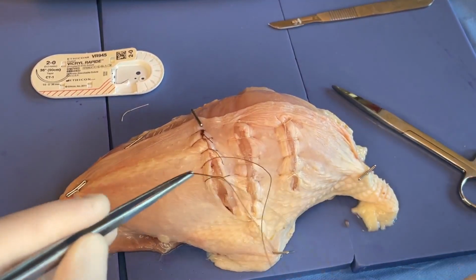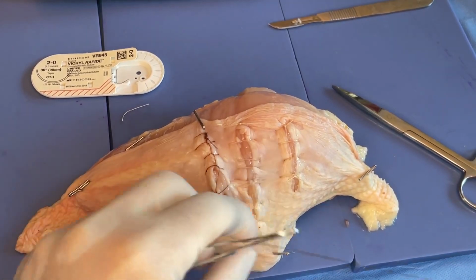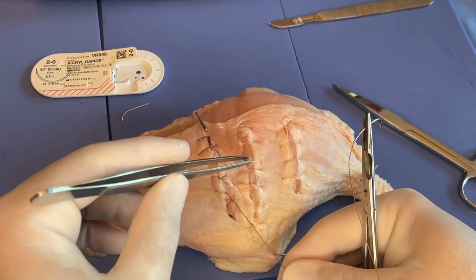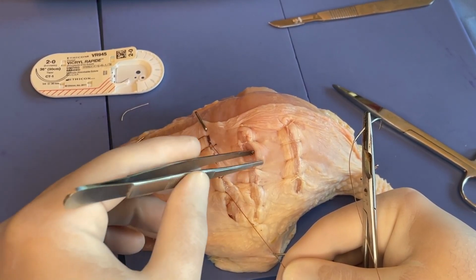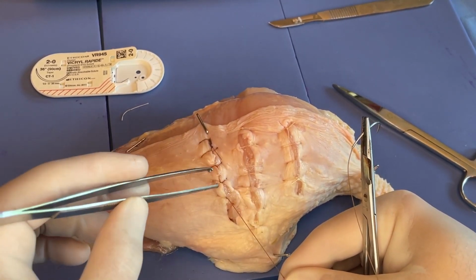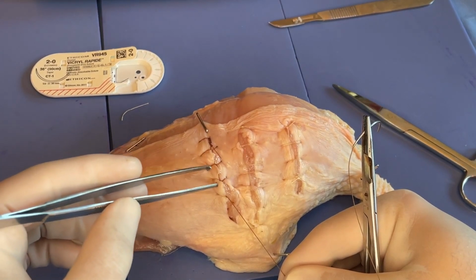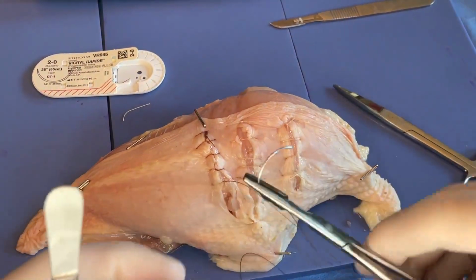So then as I tighten this down, like that. So again, you can see that we're really getting nice compression here. And compared to this running, where the tissue in between our loops of suture isn't really overly tightened, it's just tightened where the loop is passing. But here we're getting compression not only side to side with our loop, but also some of this longitudinal compression that's parallel to the direction of our incision because of the interlocking aspect of it.